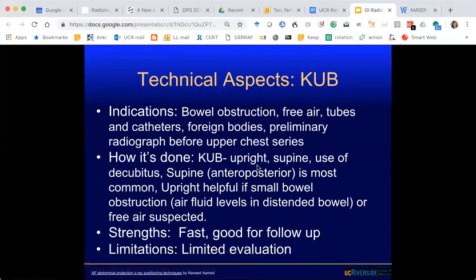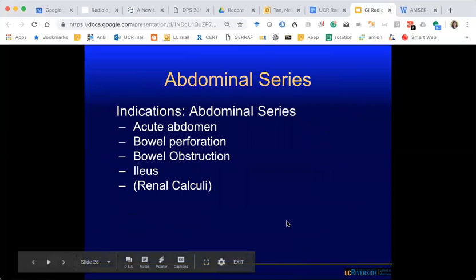KUB is your initial screening for bowel obstruction, free air, tubes, and lines. We typically do an abdominal series — a KUB plus a chest x-ray — looking for acute abdomen: obstruction, perforation, ileus. If concerned about SBO, you request an upright position because you're looking for air-fluid levels. Similarly for free air — upright increases sensitivity, because free air is very hard to see on supine unless it's a large volume. If the patient cannot stand, you can do a lateral decubitus with the liver side up, using the liver interface to bring out the free air.